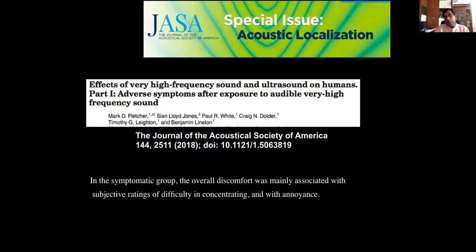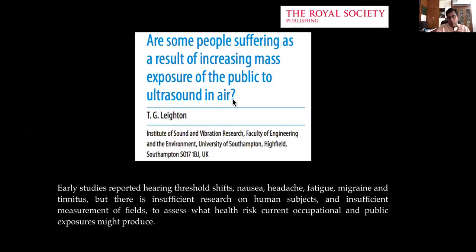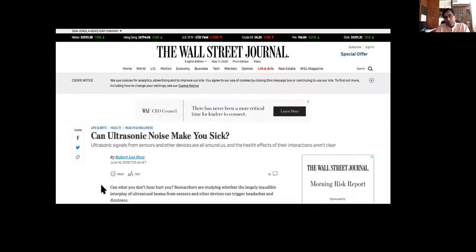Again, I tried to find out about any other problems because of the ultrasound, and there have been a good amount of publications on atmospheric ultrasonic vibrations or waves, because there are many instruments emitting these ultrasonic waves, and that leads to a lot of concentration problems and annoyance. Even complaints of vomiting, nausea and lethargy have been reported. But this is not related to the device. I just tried to find out what is there in the atmosphere from ultrasound generators in different fields, and I was able to find this. Even the Wall Street Journal has quoted, can ultrasonic noise make you sick? So this is a talked about thing.